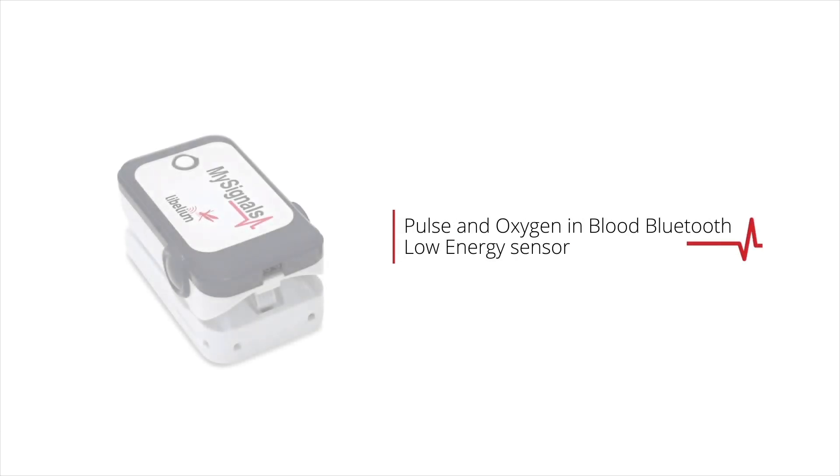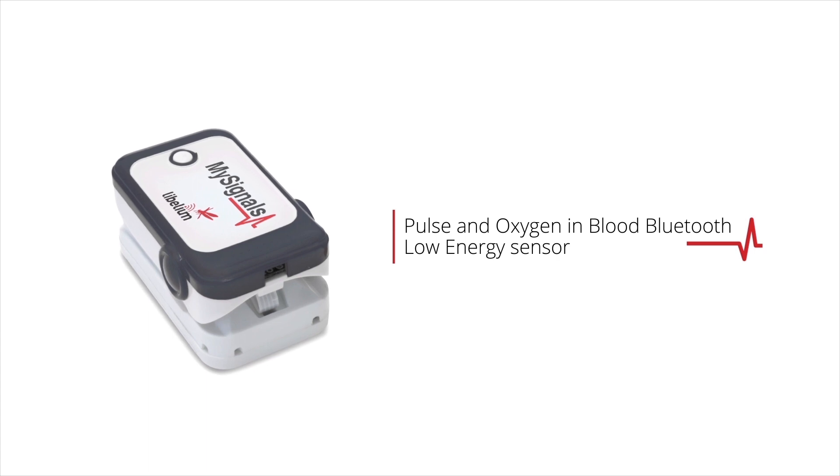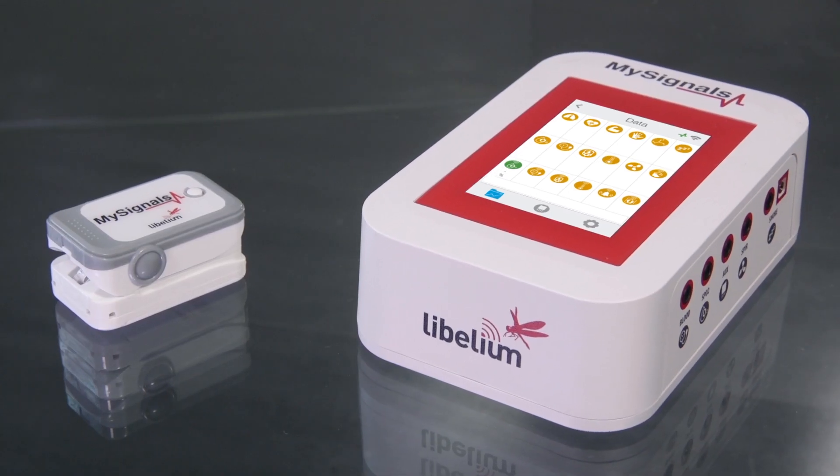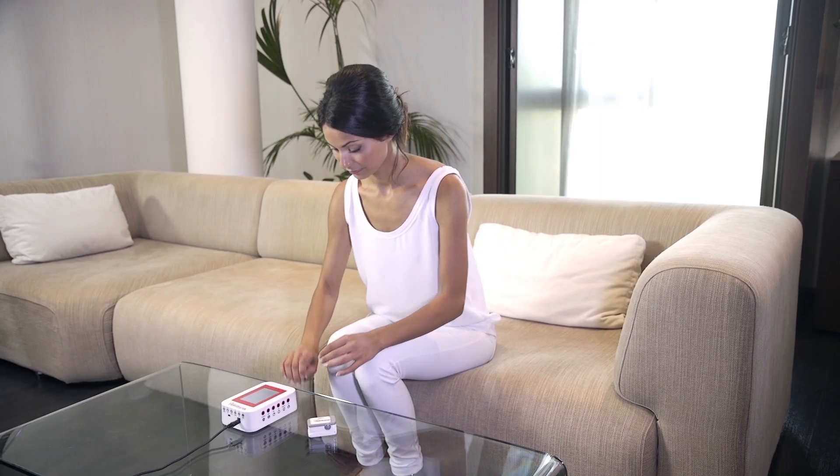How to use the pulse and oxygen in blood Bluetooth low-energy sensor in MySignals. Bluetooth low-energy sensors are paired with the MySignals development platform.